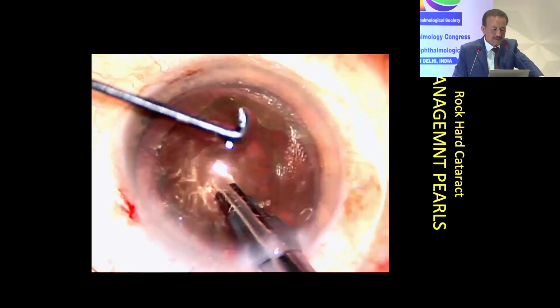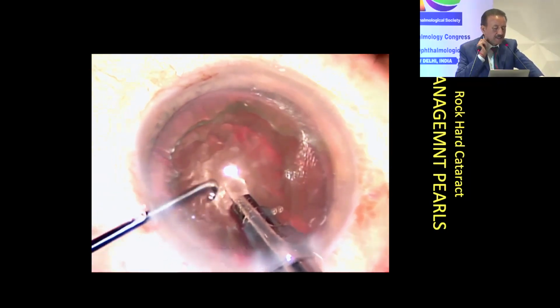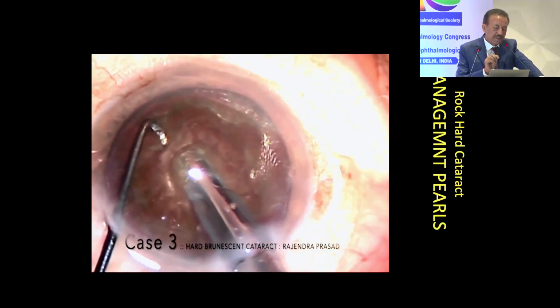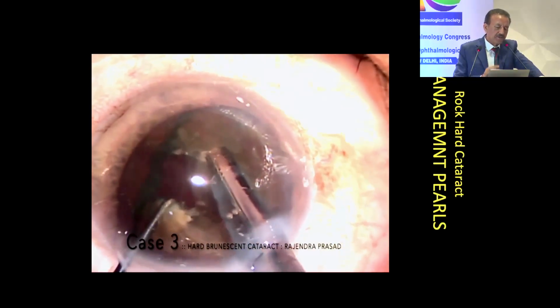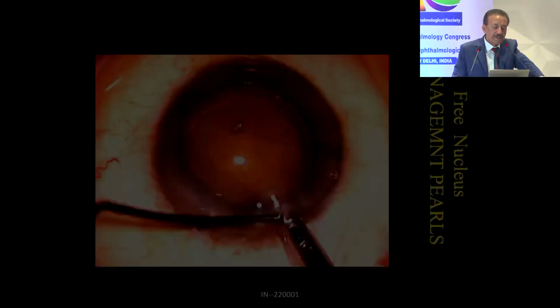And this is another case, a very hard cataract. Look at the phaco probe. This is very important. With the phaco probe, you have to penetrate not towards the posterior pole, but slightly towards the equator, then hold it, draw it a bit, and then crack here, because cracking has to happen at the equator only. Then only you get a complete splitting of the nucleus.